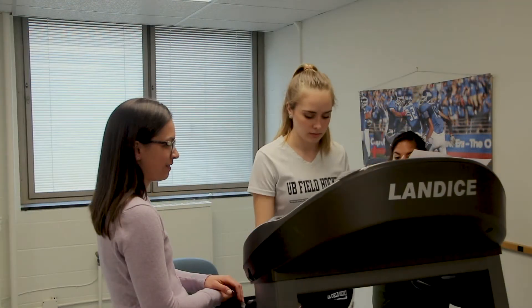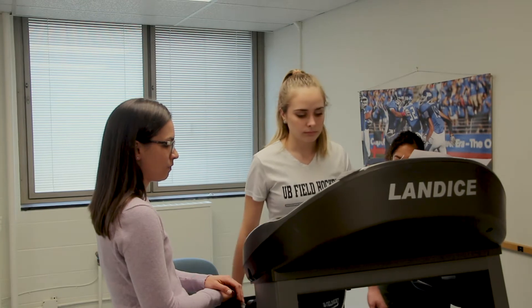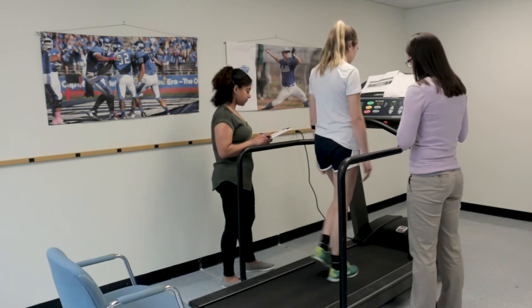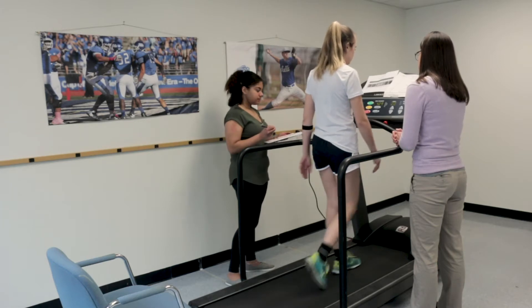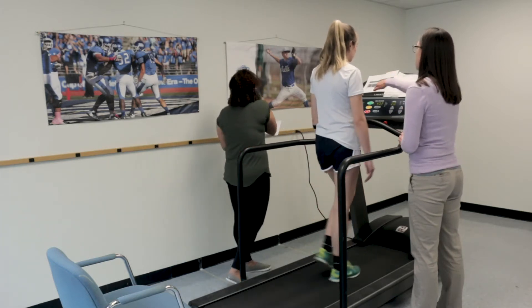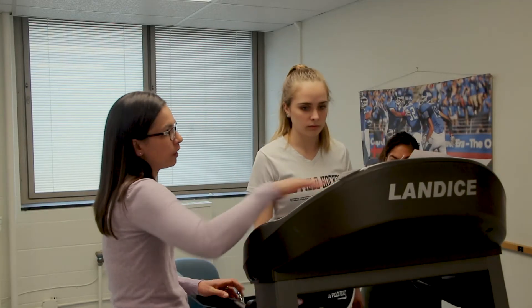We are more conservative when we're testing someone who is acutely injured. That is, we will stop the test sooner just on the basis of how the person looks. If they show distress, we will often stop even if they don't necessarily move three points on the analog scale as our manual would dictate.